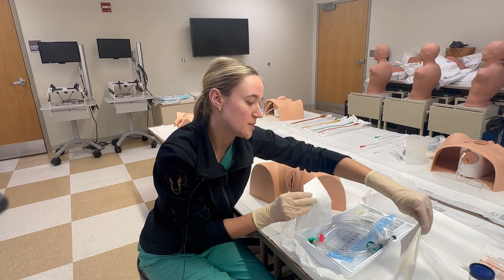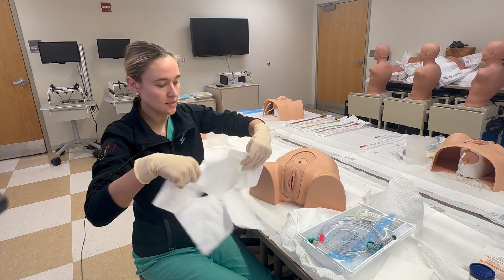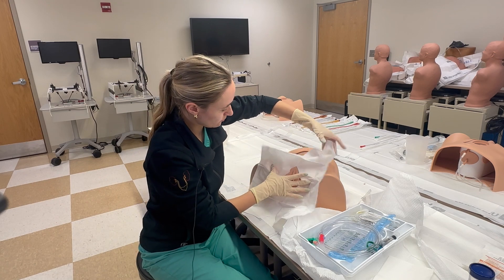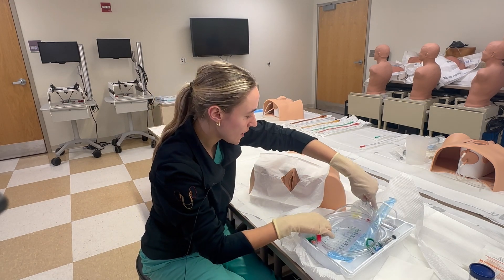In males we'll use this fenestrated drape, but we can set it to the side for a female. We'll go ahead and place this kind of right over this general direction.